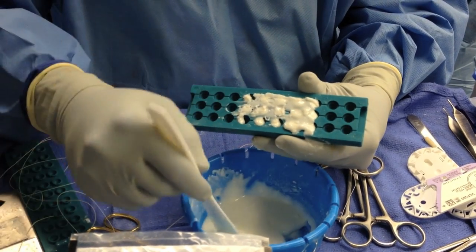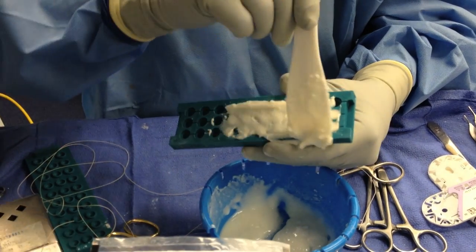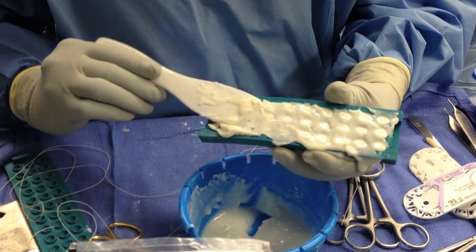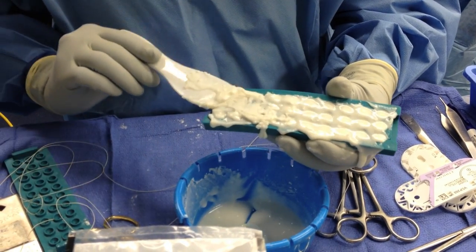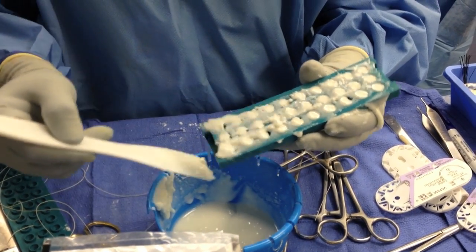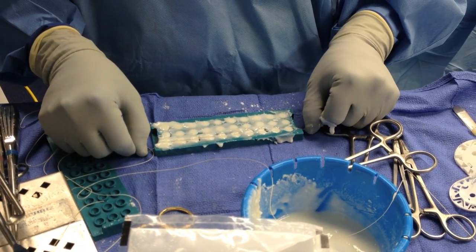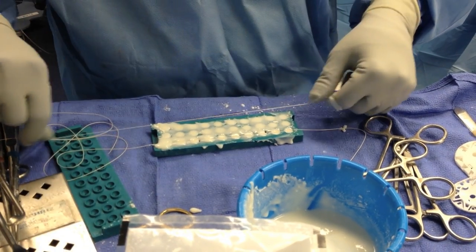This is a commercially available system to make antibiotic beads. Basically this is a flexible rubber type material with holes that are filled with the cement. Once all the holes are filled, excess cement is removed in order to minimize need for clean up after compression. Typically non-absorbable suture is utilized in the string holes to set in the cement. This allows for easier removal later as all the cement balls will be tethered together.